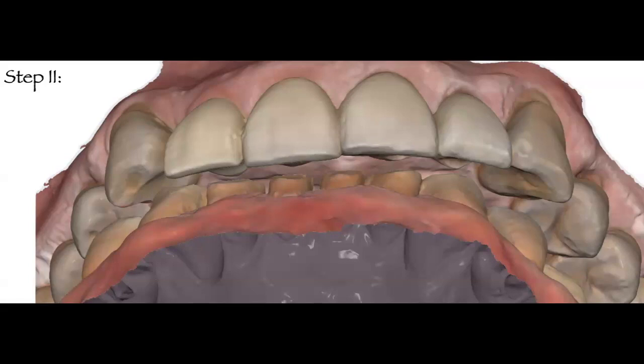And I also am going to have to, of course, add some composite, most likely to the maxillary lingual surfaces from canine to canine. And I'll show you what it looked like after I was done with my wax up. But for now, I want you just to visualize this is the new vertical dimension. This is the increased vertical dimension where I am going to restore this patient temporarily with my prototypes, and I'm only going to focus on that anterior guidance.